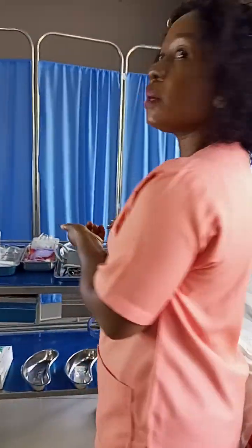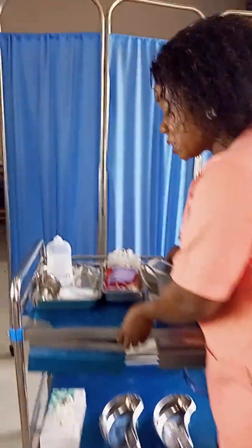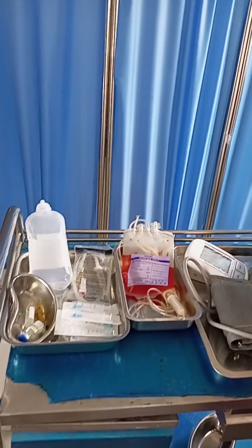On Nurse Clement B today, I'm going to demonstrate the nursing responsibilities in blood transfusion under the following headings: before, during, and after blood transfusion. Do not forget that before you start any procedure in nursing, you have to set what? Requirements, of course. You have to set your requirements, and this is my requirements.